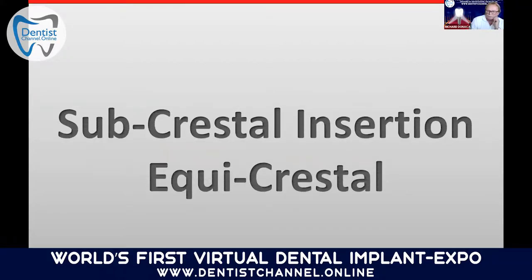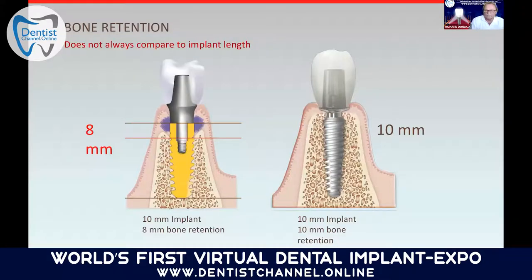Subcrestal insertion is something that the implant should be able to do because if the literature is saying 1.6 millimeters of bone loss, then you would want an implant that will uphold the bone, and this is subcrestal insertion. Otherwise, say a 10 millimeter implant is really only going to end up with 8 millimeters of bone retention.